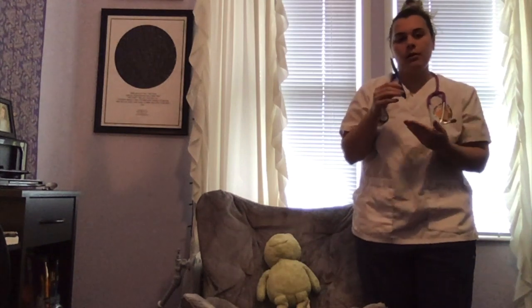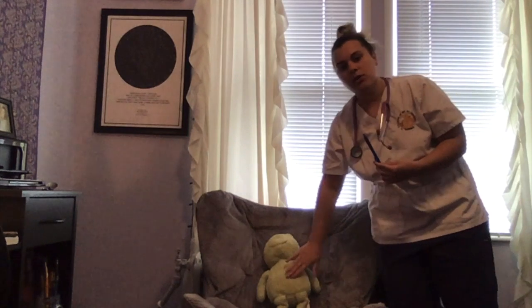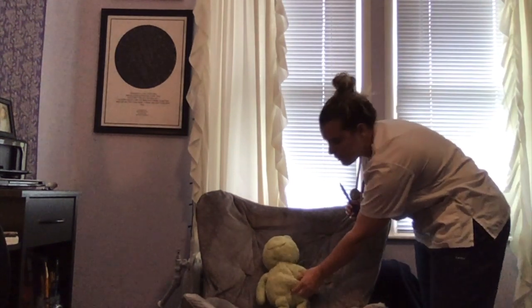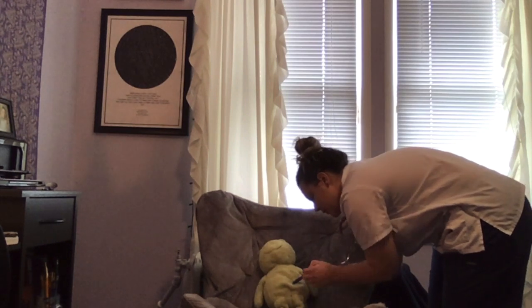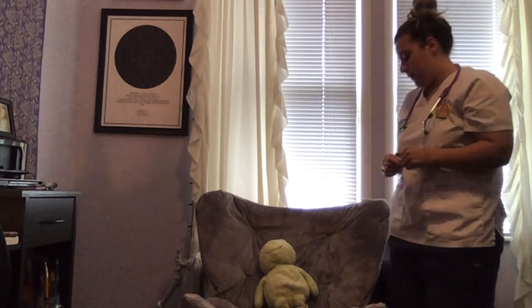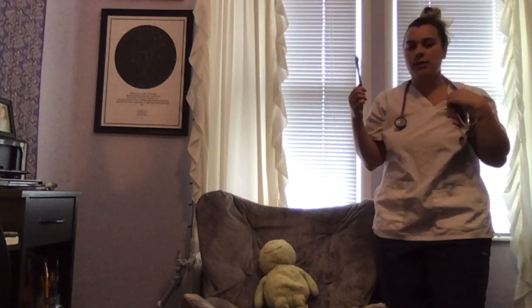So I already have my insulin made up. This is my needle, my plunger side. I would go in, I would clean the injection site first to prevent infection. I would squeeze at the abdomen. I would inject, release, and push in the plunger. I don't want to rub the site at all. And then that's the end of the injection. And then I would want to put this into the sharps container so that it doesn't harm anyone.